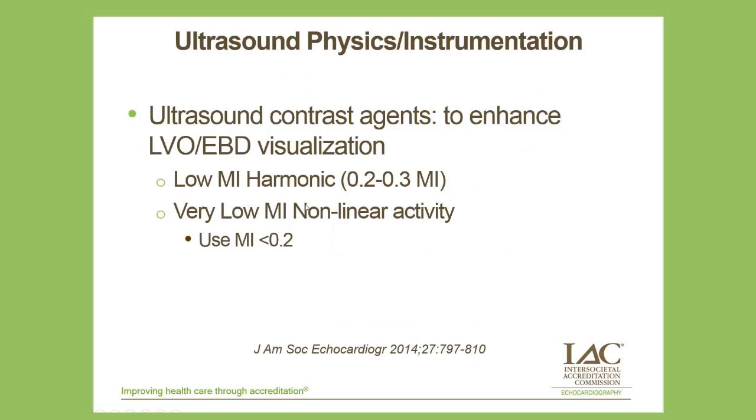Now, I want to conclude by discussing a little bit about the very low mechanical index techniques that are on, again, most of the commercial systems. They've been available for over 15 years, and now they're on systems, but we have a little problem with our vendors, perhaps, in helping us understand where they're located or how to get them.